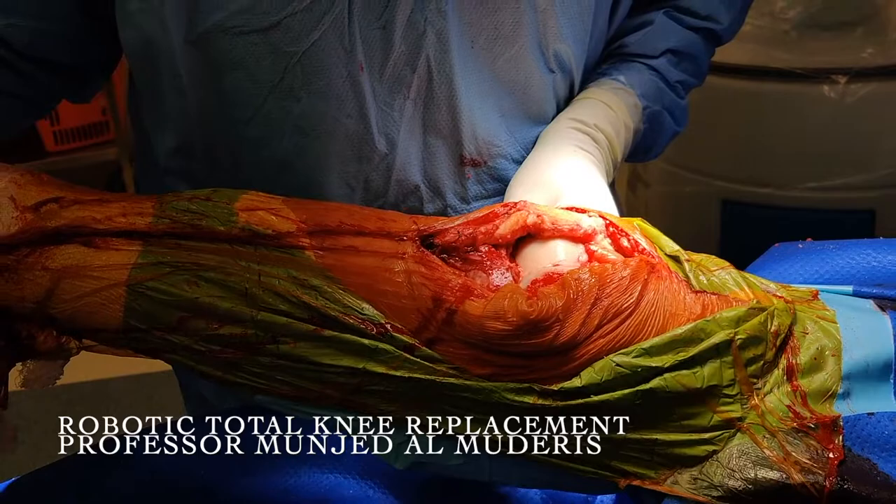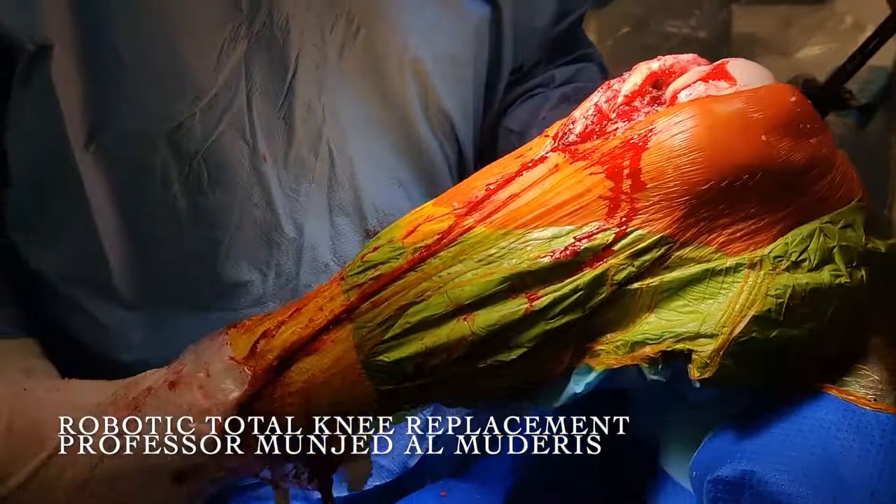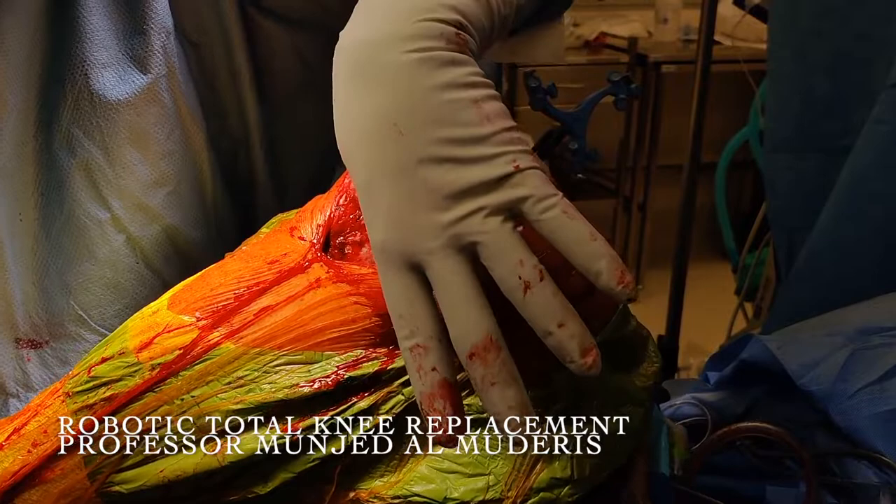The knee is still in varus and significant fixed flexion deformity, but there is more opening on the medial side with the ligament intact.